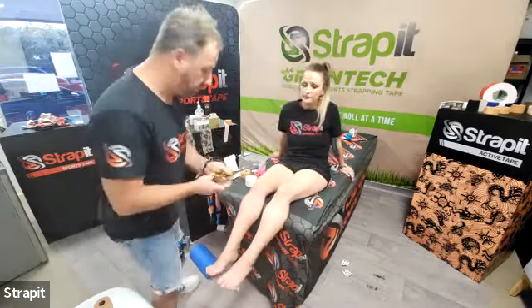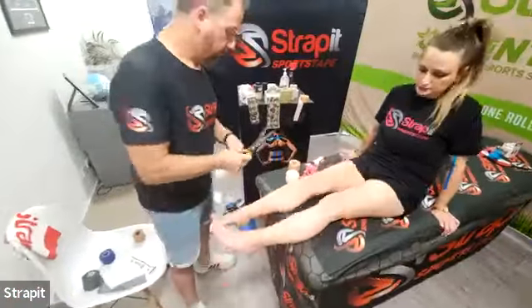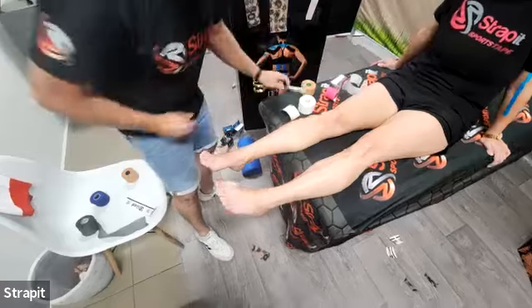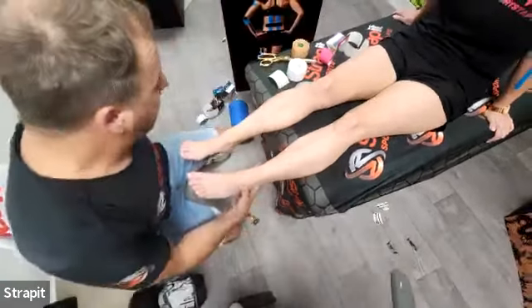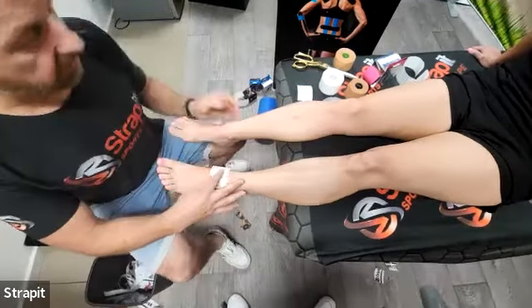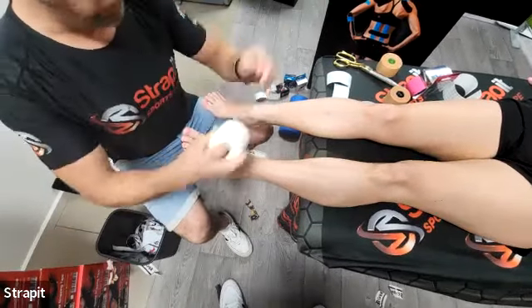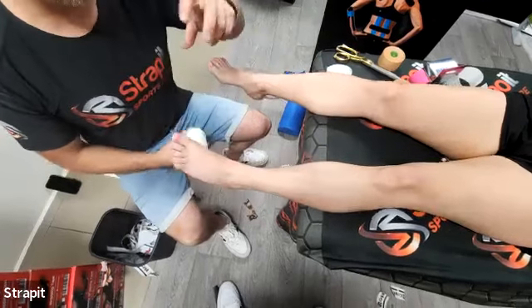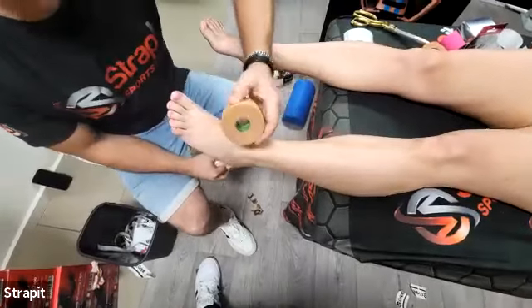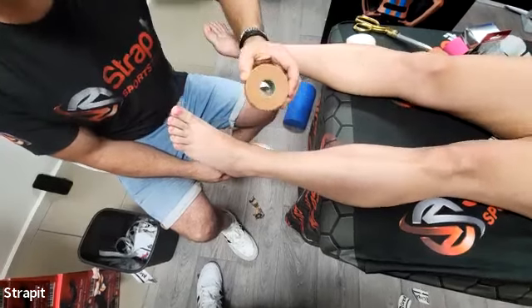So I'll get Conrad to come in with a bird's eye view here. When I prepare the ankle, if you're dealing with a very professional elite athlete, you may prepare the whole foot with a fixation tape. For most people in the clinic, you don't really need to do that full prep unless they're allergic to latex, if you've got latex in your adhesive. One thing about some of these newer tapes like the Green Tech and synthetic rubbers — the newer technology — they don't have latex, but they're just as sticky.